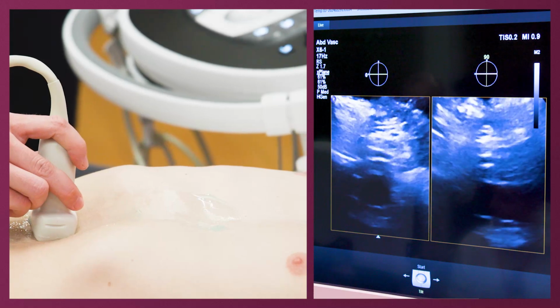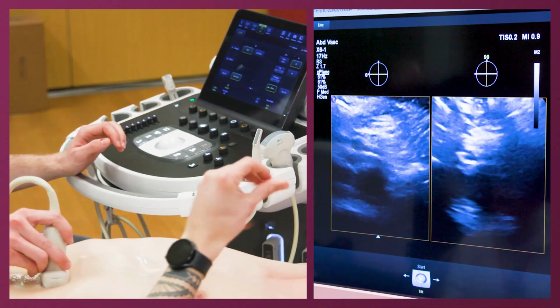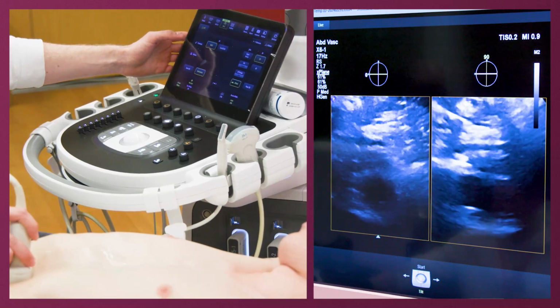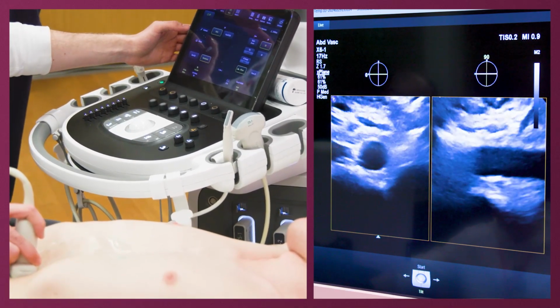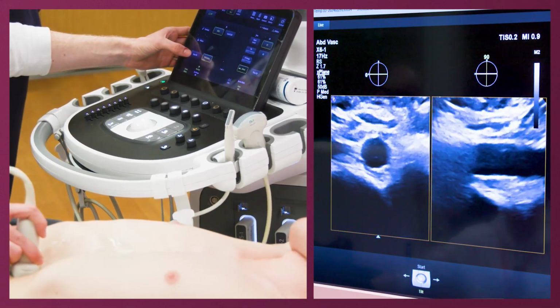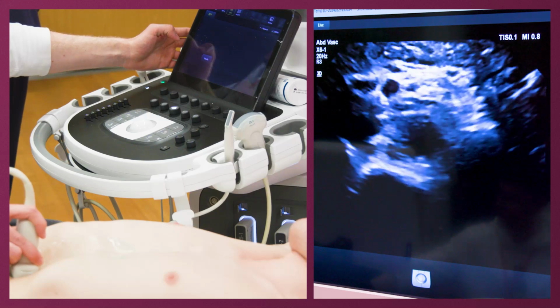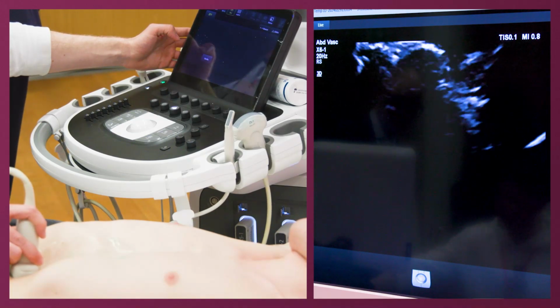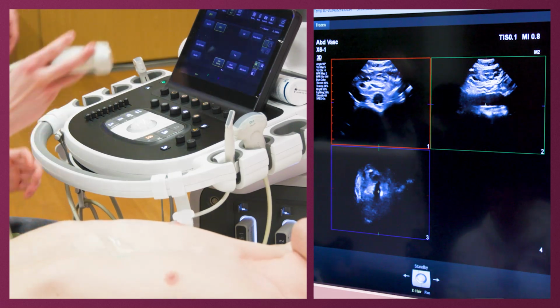You need a live image, and you can see this button here called Start 3D. Okay. And I have to focus on something? No, you just need to have a steady hand, and you need to have the vessel in the middle of the image. Okay, like this. Yes. And then breath hold. Hold your breath. Push. Thank you.